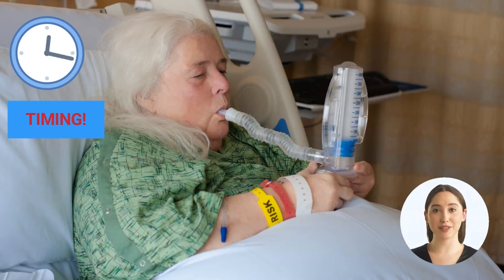Prior to incentive spirometer teaching, ensure that your patient is alert and oriented, that they are comfortable and free of pain, and that this is a good time to conduct a teaching. Teaching should not be done when a patient is drowsy or unable to participate.